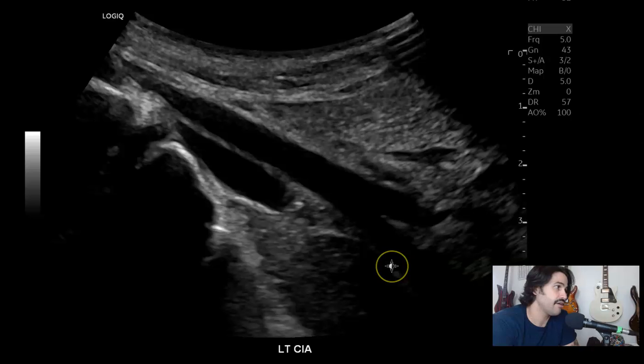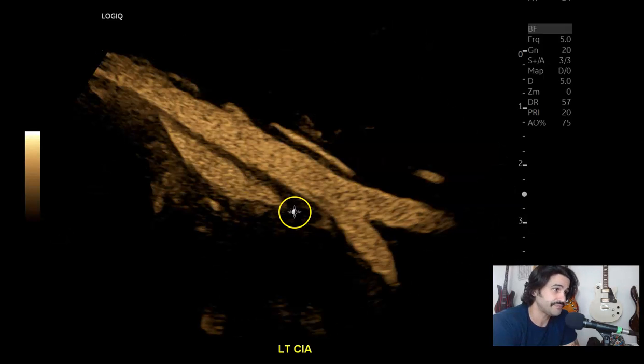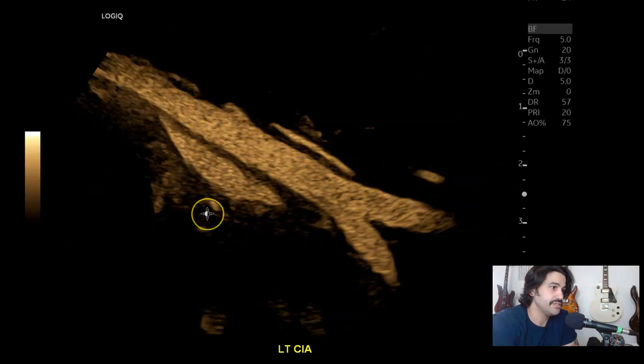The bifurcation of the common iliac artery. Especially on skinny patients, it's good to know not to press too hard. If you come here and press really hard and try to Doppler that, the velocities are going to be elevated. They'll be normal waveforms, but elevated just from the pressure you're putting on the vessel. So external iliac artery, internal iliac artery, common iliac artery with B-flow — nice bifurcation.